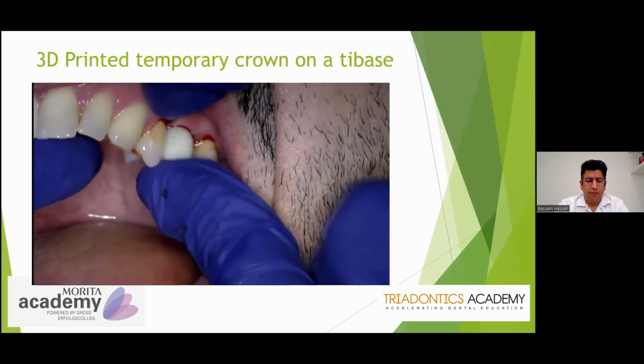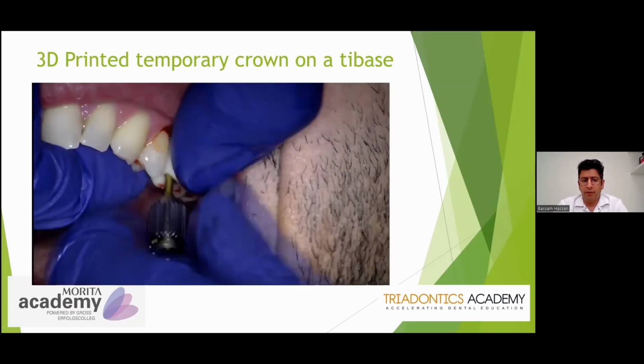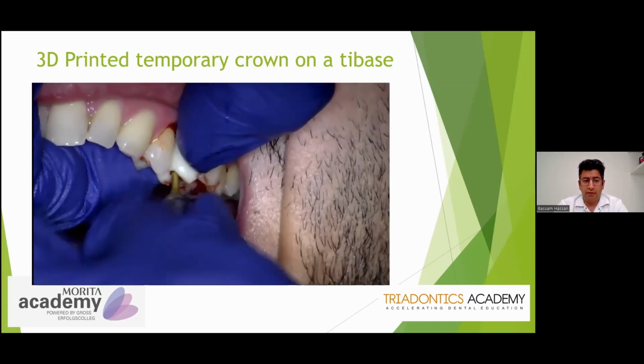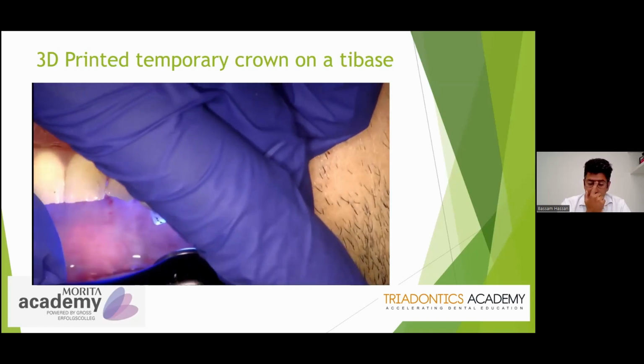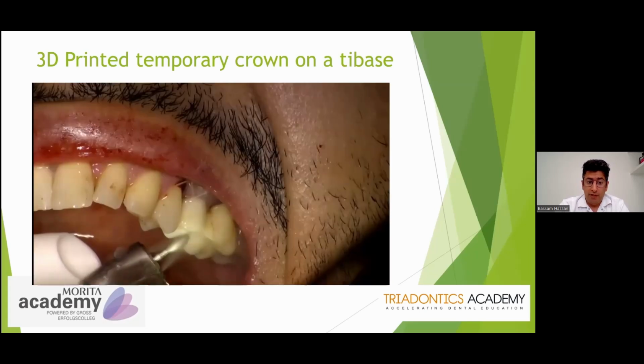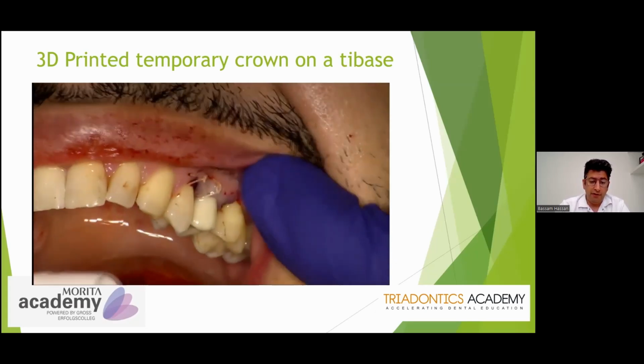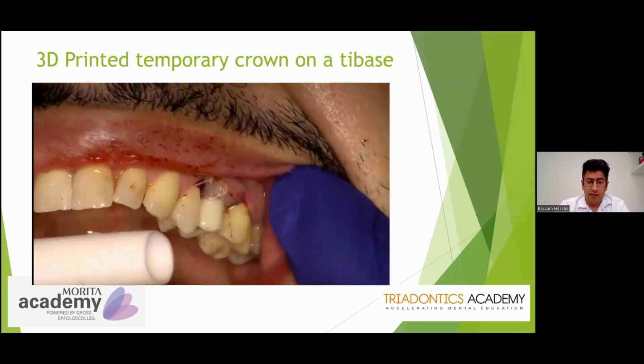That's actually what most people think about when they think about going digital, because if you are already outsourcing those cases to the lab, then you're already losing a lot of revenue, and you are becoming highly uncompetitive. If you have a 3D printer in the practice and an intraoral scanner, and you have the ability to source in a designer, then nowadays, also with AI, you can do this stuff within a couple of hours.